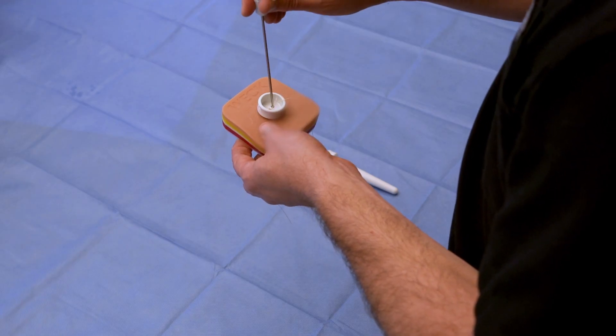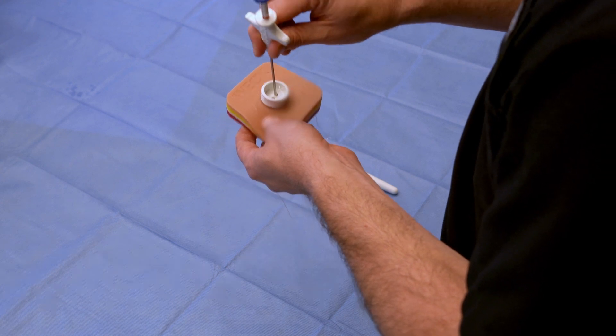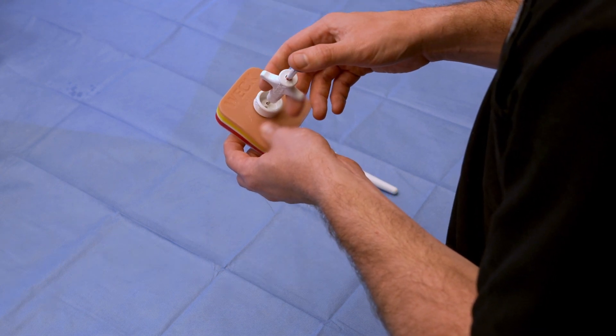Under direct visualization, insert the passer tip through the opposing pilot guide channel without the suture and without pressing the button.